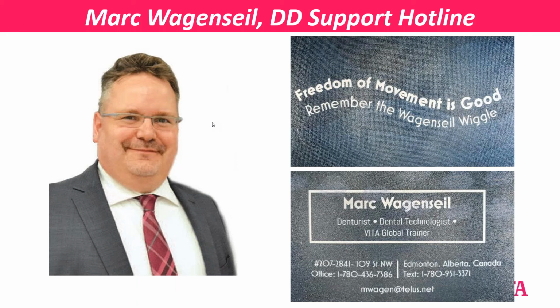Because not all their teeth have freedom in centric in them. So if you're looking at their baselines from the 50s, those are all not freedom in centric teeth, so I don't use that anymore. I've used products from many different manufacturers, and I've settled on this because of what I've just spent the last hour and a half chatting to you about.